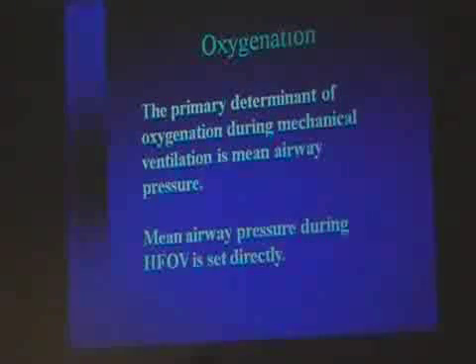So the primary determinant of oxygenation during mechanical ventilation is mean airway pressure. This is exactly the same as during conventional, and mean airway pressure during HFOV is set directly. When I ask you on rounds, what is the primary determinant of oxygenation on this baby on an oscillator? Your answer should always be mean airway pressure.